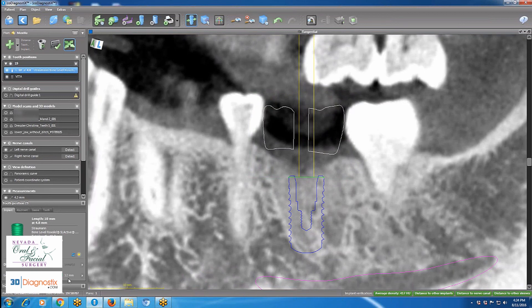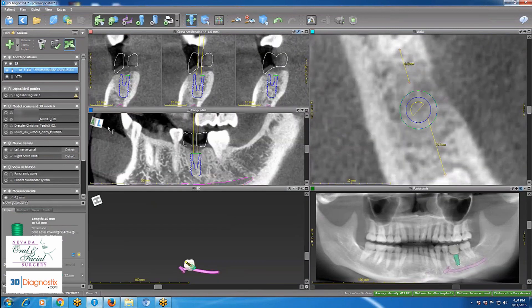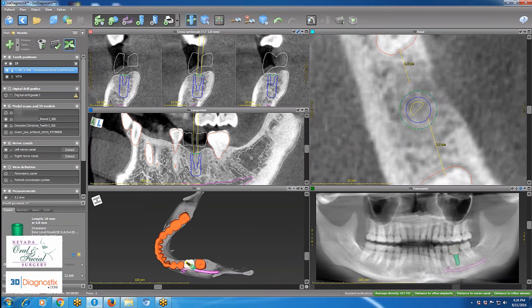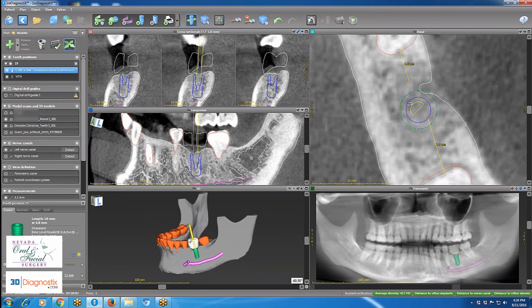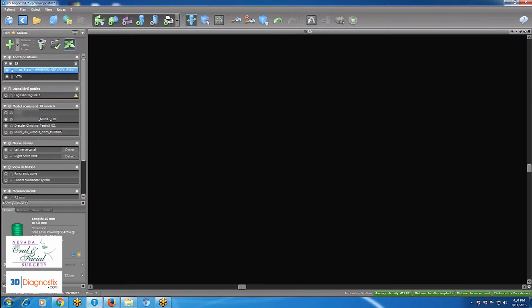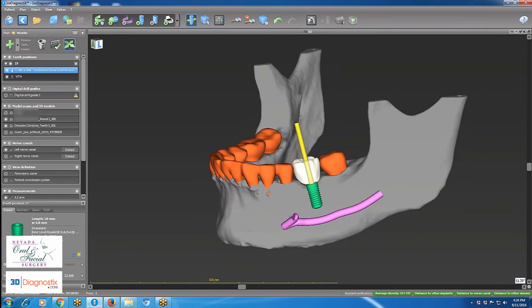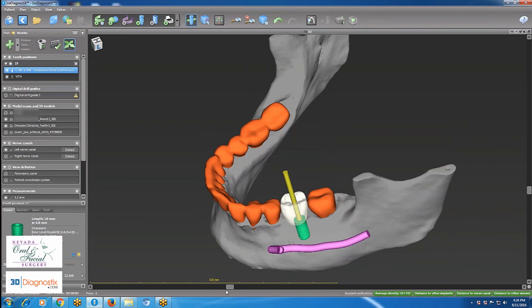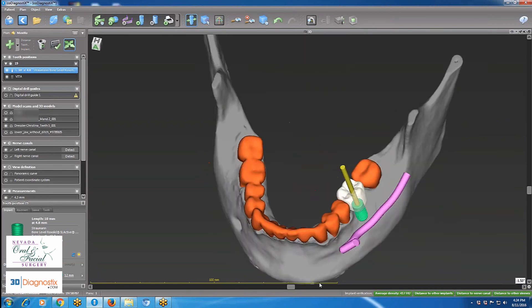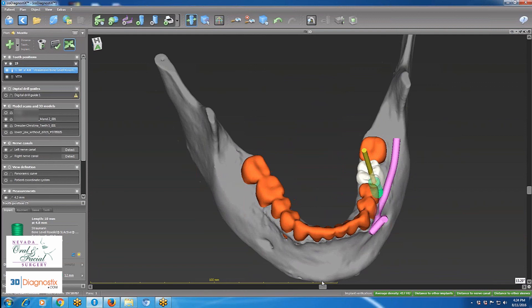If I try to use a longer implant — a 4.8 by 12 — I get a warning at the bottom right that I'm too close to the nerve. So I go back to a 4.8 by 10. In the 3D view it appears well-placed in the center of the available space, both mesiodistally and buccolingually.